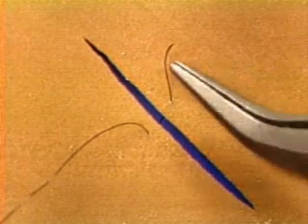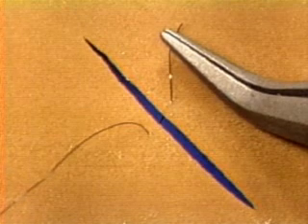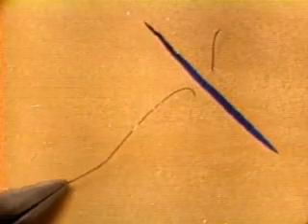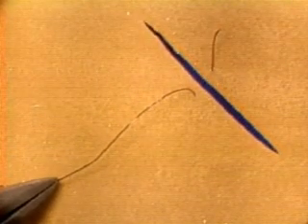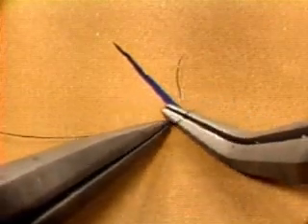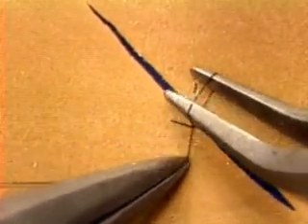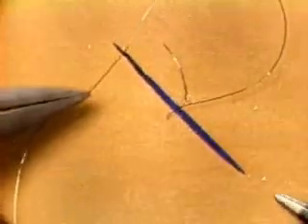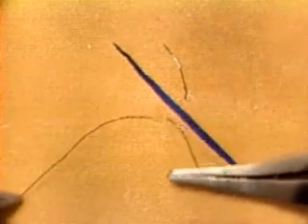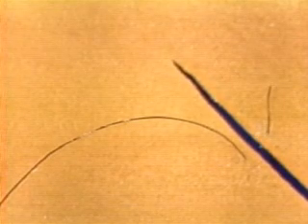3 millimeters is a good length for the short end. That's a little shorter than the tip of these angulated forceps. For the loop, you need a length of thread about 3 times as long as the short end. If the loop is too short, again, this happens. If it's too long, you can't work with it concisely, and you'll have to make oversized movements to get it to behave. Let's get back to the action.